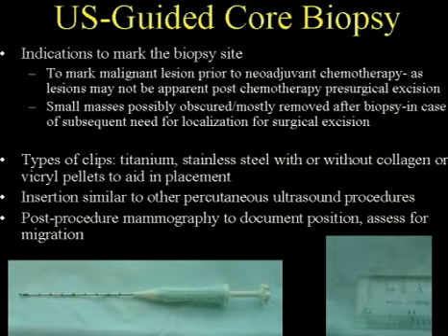The other issue is whether to mark the biopsy site with a biopsy clip. Indications for this would be to mark a malignant lesion prior to neoadjuvant chemotherapy, as lesions may not be apparent after chemotherapy. The area usually is still surgically excised, and so a clip is helpful to mark the area. Also, small masses may possibly be obscured or mostly removed after biopsy. So in case of subsequent need for localization for surgical excision, it is helpful to have a clip in place.